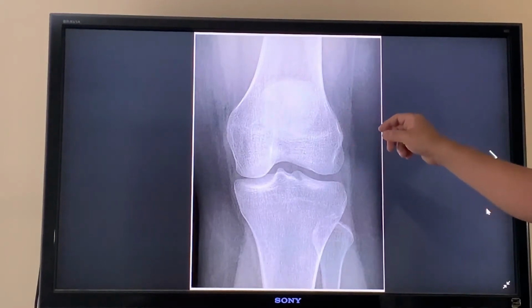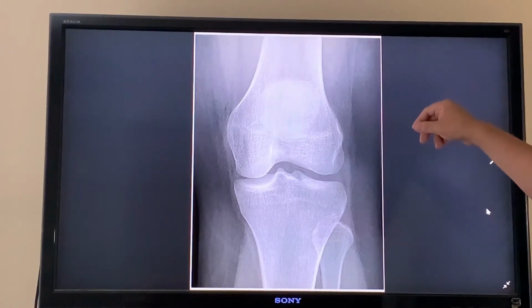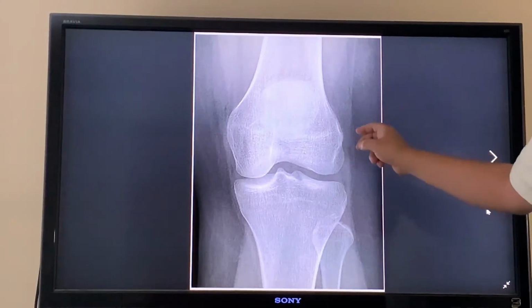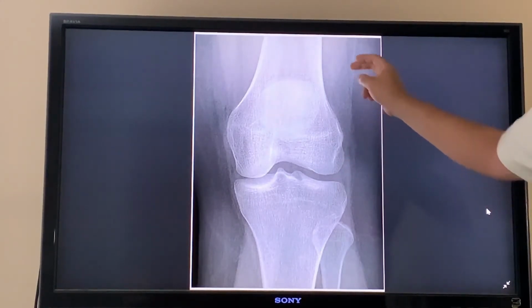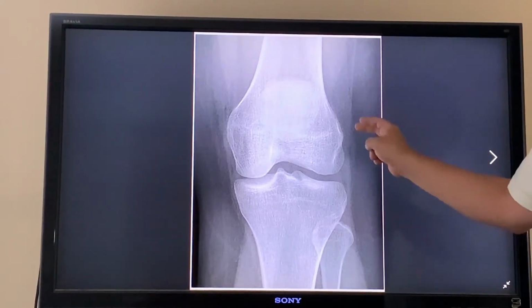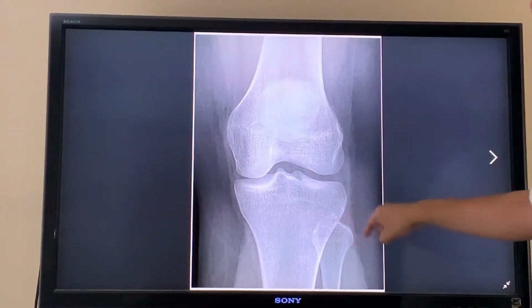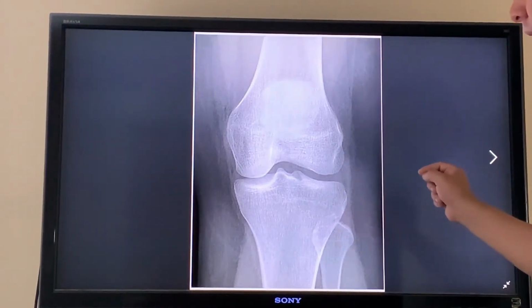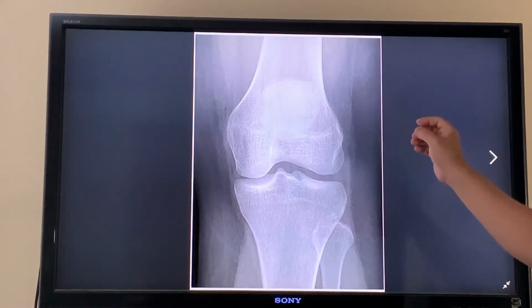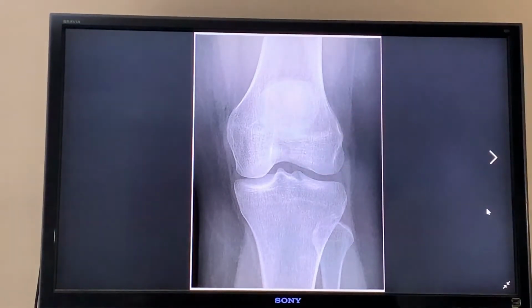This can be evident by the femoral tibial joint, which is completely open. We're also going to see no rotation because the condyles are both symmetrical with each other. The patella is superimposed over the femur. We can also see a clear view of the intercondylar eminence, as well as the tibia superimposing over the head of the fibula. The central ray is half an inch inferior to the apex of the patella, which is pretty much this section right here.